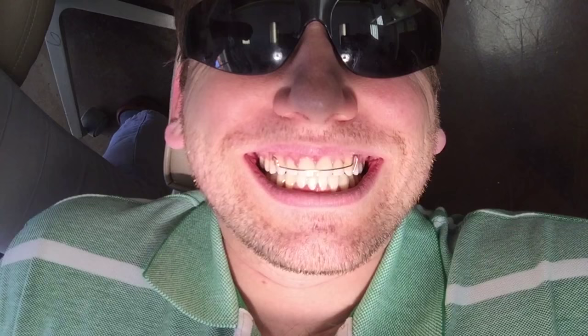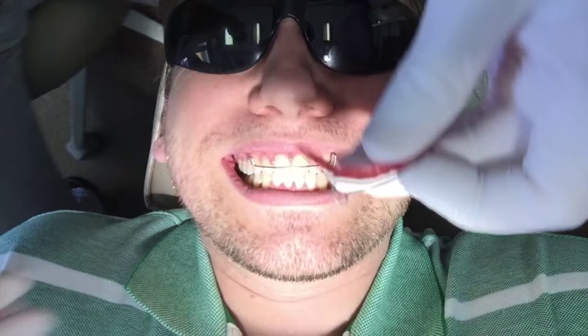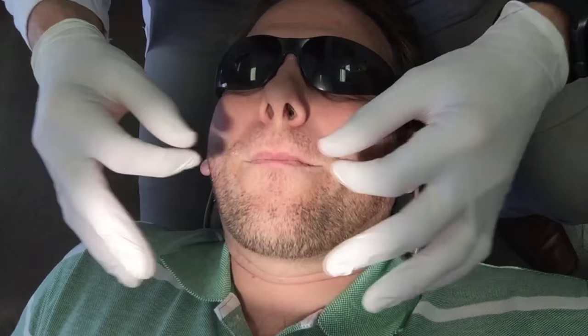I can feel that. The orthodontist asks how it feels — snug, not poking or pinching?